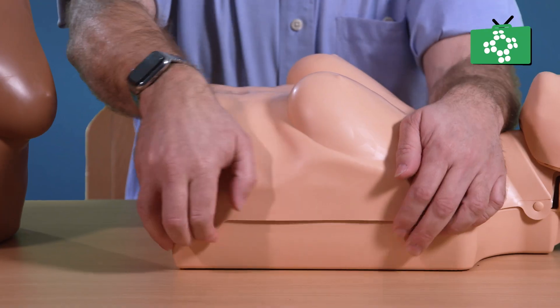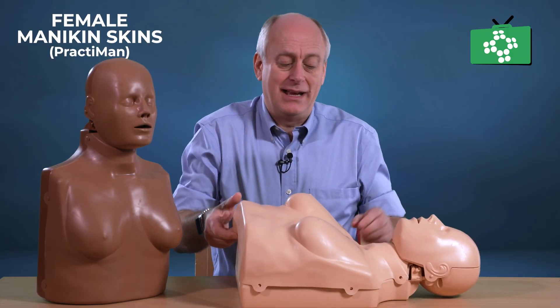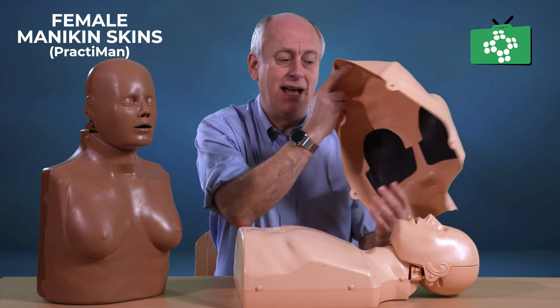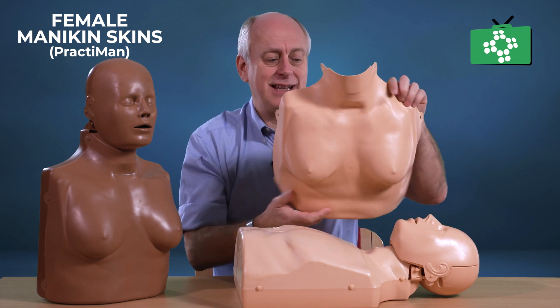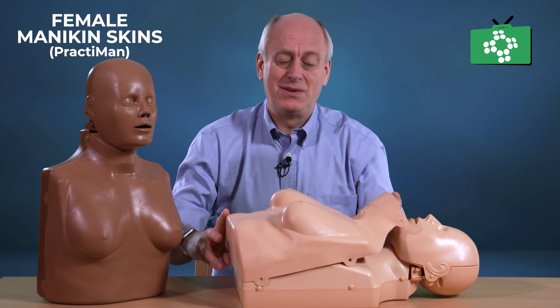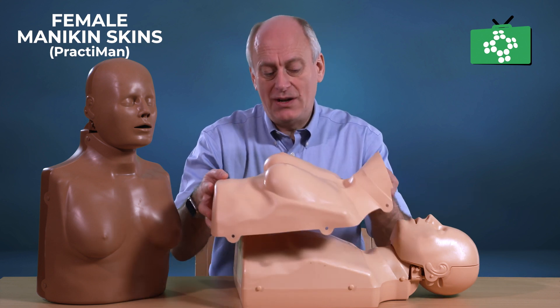The way these things work is all you do is remove the standard skin from your mannequin — literally just undo the six little clips here and the skin comes off. This is where you would put the lungs in, and then the skin itself comes in a box and is ready to go. You can store it easily and when you're transporting it, it's easy. Either you can set up your mannequins permanently with the female skin on, or you can switch depending on the group, so you've got both the male version and the female version.